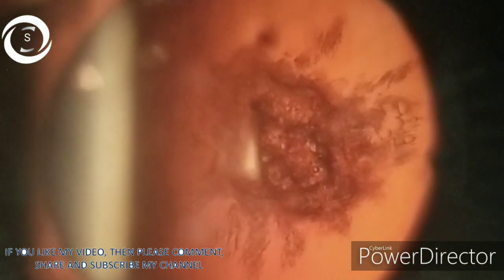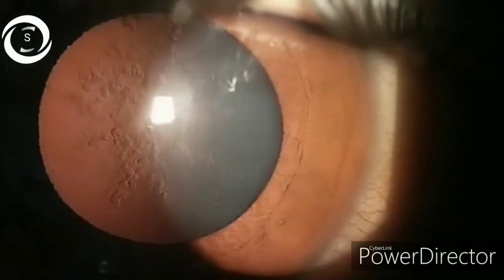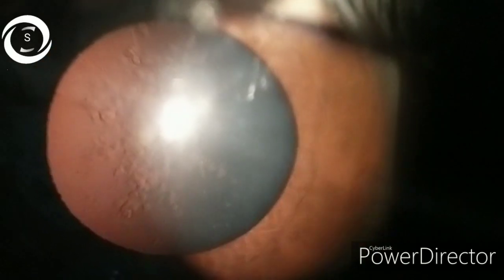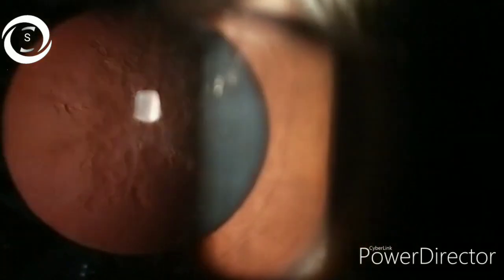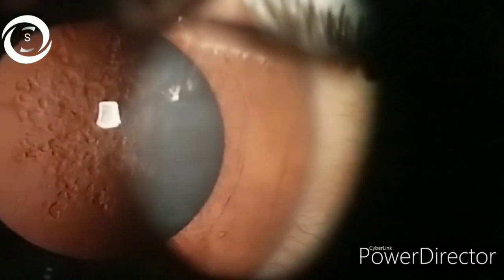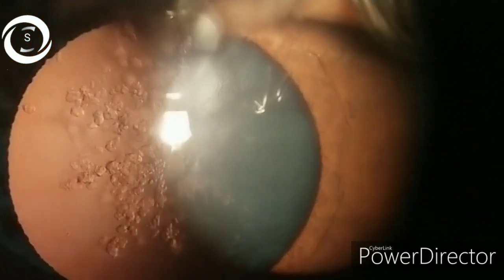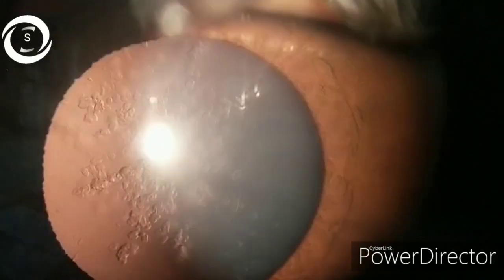The structure behind is used as a mirror to illuminate the part of the eye in question. Now in a third patient you can clearly see crystal-like opacities arranged in a star-shaped pattern — a star-shaped cataract on retro illumination. You can see that the beam is on the edge of the pupil: half of the slit is falling on the iris and half passing through, and the star-shaped cataract is illuminated.